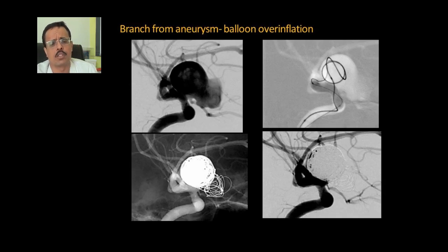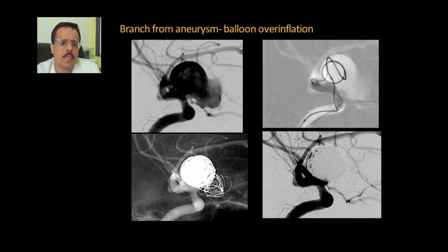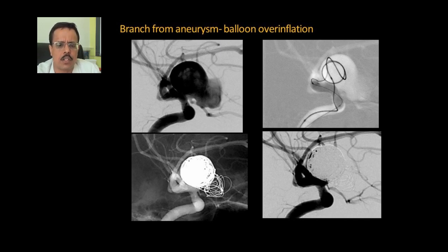Some patients have a branch coming from the aneurysm, for which we use the balloon overinflation technique. This is a giant ophthalmic aneurysm with the ophthalmic artery — the artery to the eye — coming from the base of the aneurysm. We overinflated a balloon and then started coiling, sparing a little bit of the neck along with the ophthalmic artery, resulting in a pretty good occlusion.